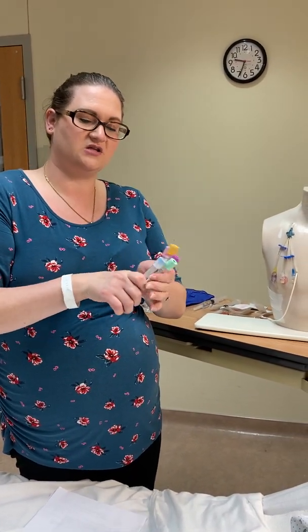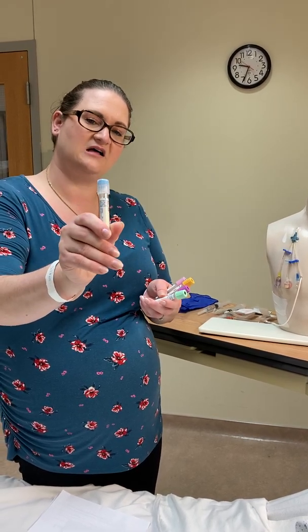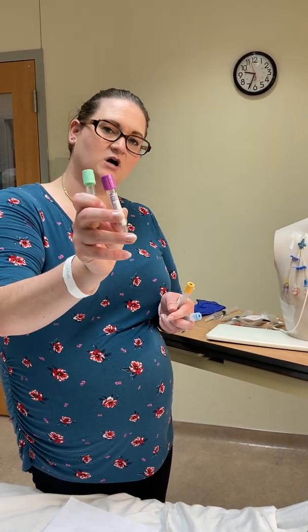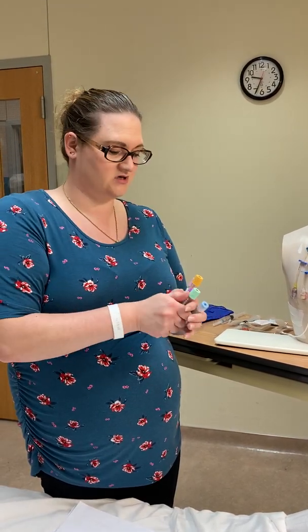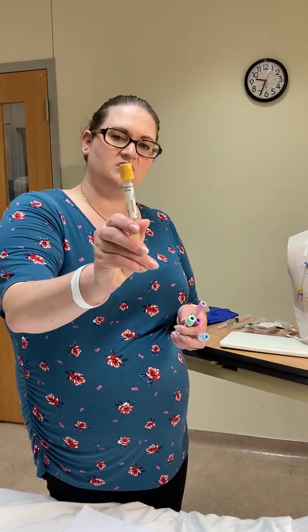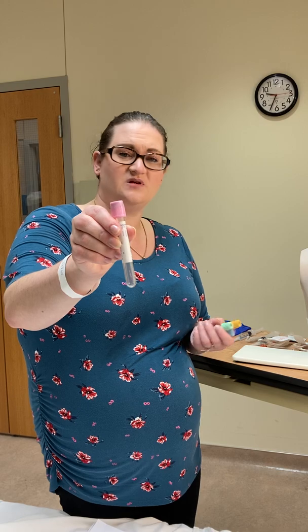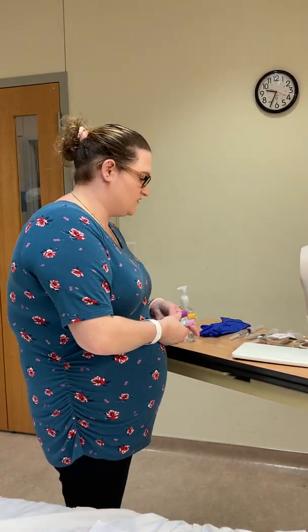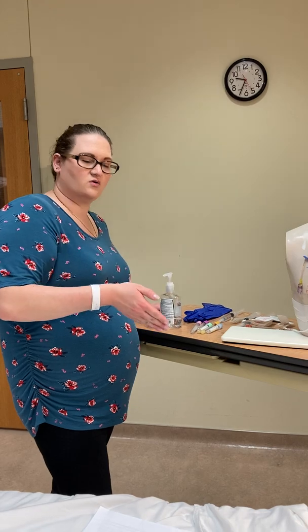Follow your facility's guidelines for which test tubes to use. Light blue is for coagulation studies, mint green is for electrolytes, lavender is for complete blood counts including white blood cells and platelets. Yellow can be used for certain electrolytes and liver or thyroid studies, and pink is used for type and screen to determine blood type. Select tubes based on the order.